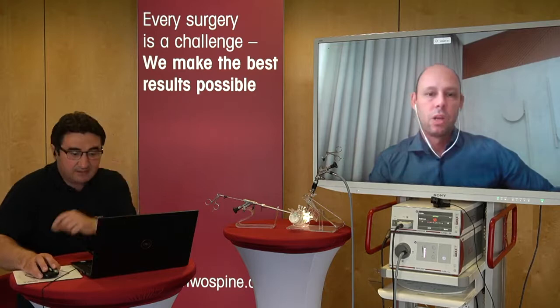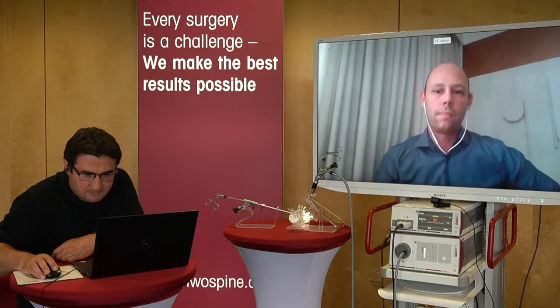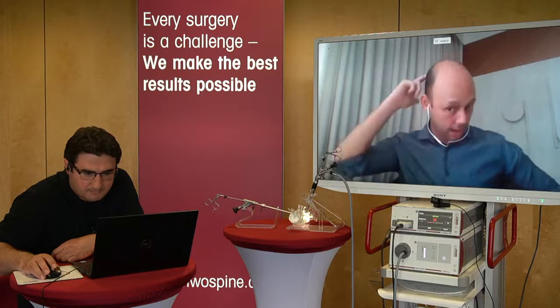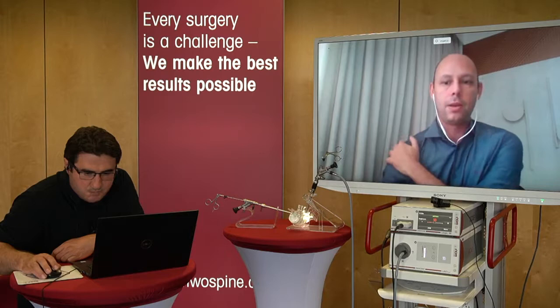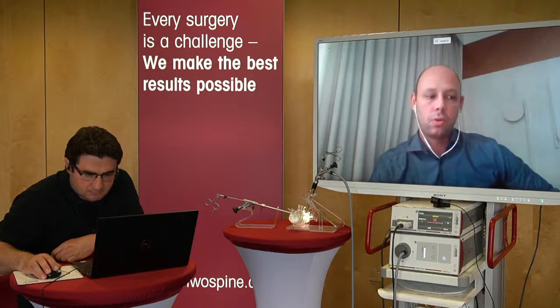Yes, it's good because it's the same as the anterior cervical approach, but from the other side. You can put the patients with a material here in the chest and flex the neck and put their arms down with tape. I put the tape here, put the arm down here. But it's easy. C6-C7 is easy. It's more difficult at C7-T1.